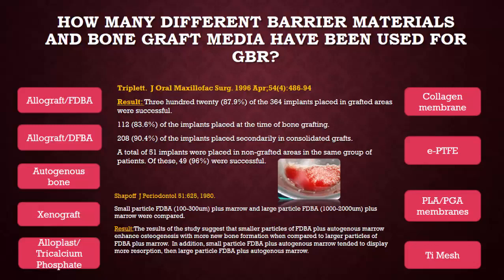According to the membrane, we can use either collagen membrane, or EPTFE, which is a non-resorbable membrane, or polylactic acid membrane, which is a synthetic resorbable membrane, or we can use the titanium mesh.